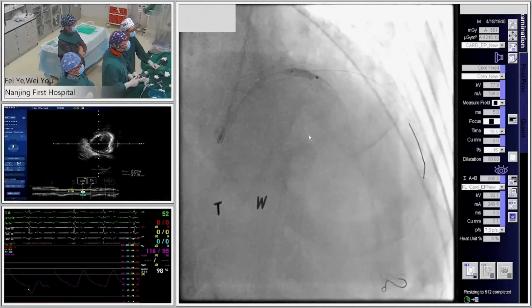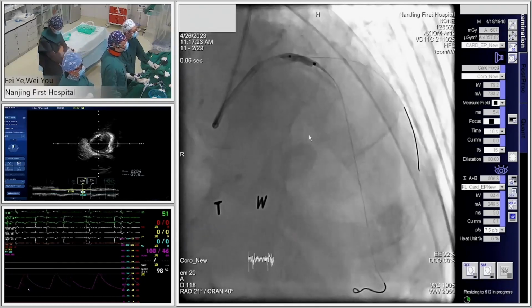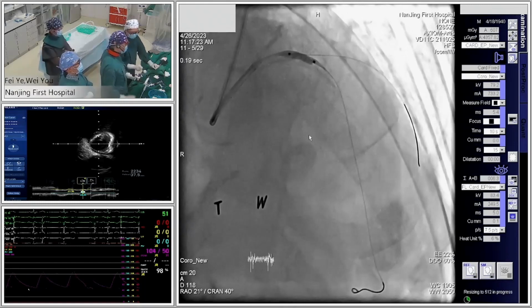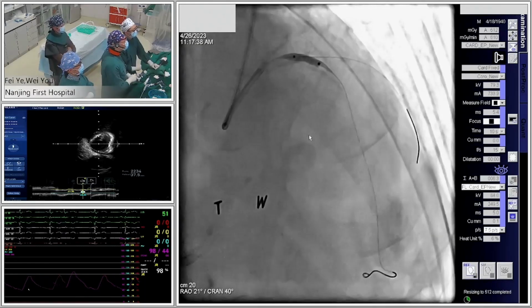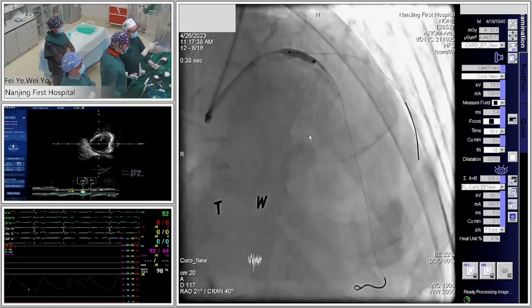This is a T-Wave, domestic. Yes, here. So if we prepare the lesion proximal just at the side of the bifurcation, we can decrease the carina shift or plaque shift during the main vessel stenting. Good. So this is a 3.0 T-Wave full expansion.